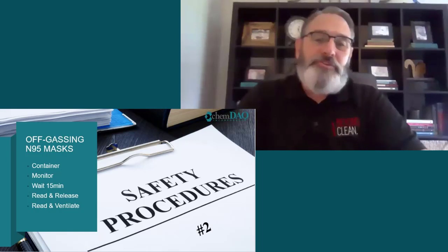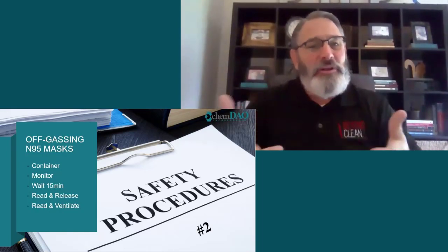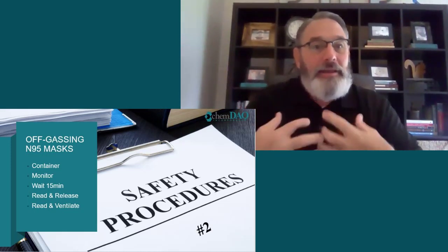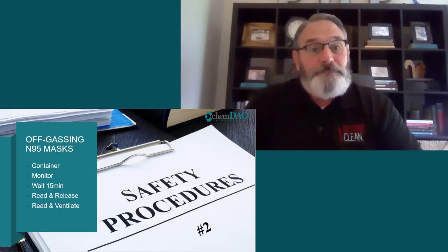That's a great point, Richard. Thanks. So can you explain what off-gassing means? Do I really have to do it in hospital? I never did this when I was running my own sterilizers.